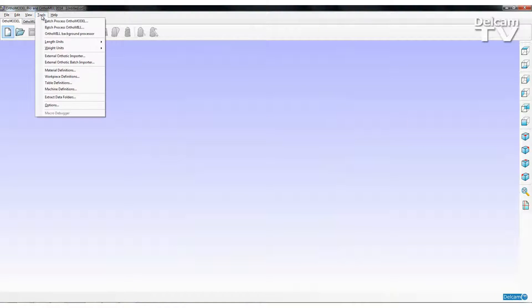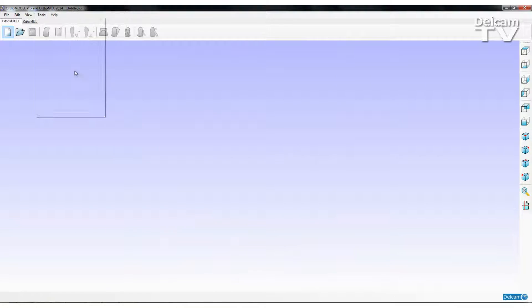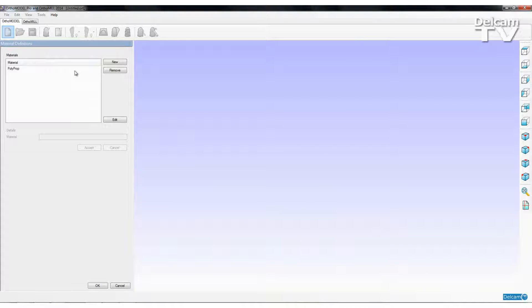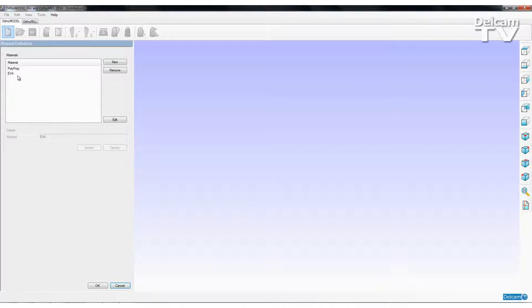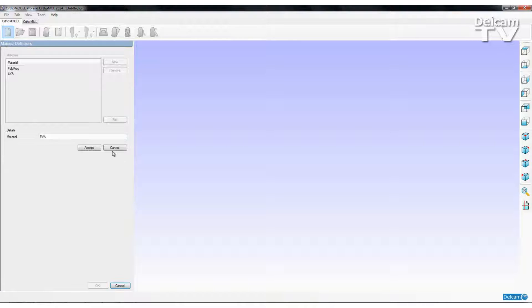The next new feature is a completely new definition added into OrthoMILL: material definitions. If I click the materials definitions option, you can see that on the left hand side we now have a list of all the different material definitions currently in OrthoMODEL. At the moment I just have one material definition which is polypropylene. I'm now going to create a new one, I'll call this material definition EVA and say accept. You'll notice there are very few options when creating these material definitions — it is literally just a name. So now I've got polypropylene and EVA material definitions stored in my materials library.